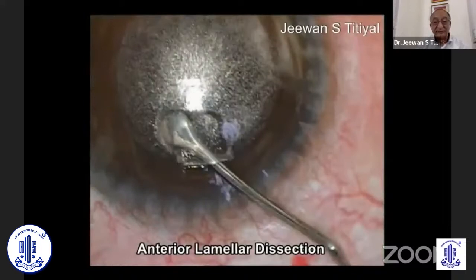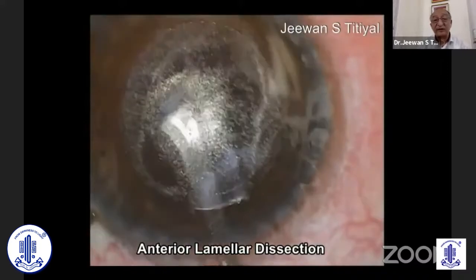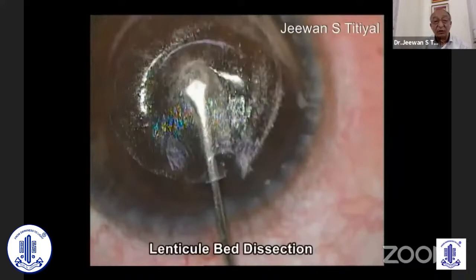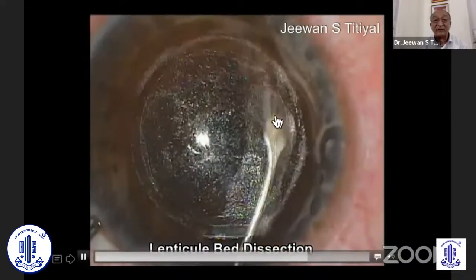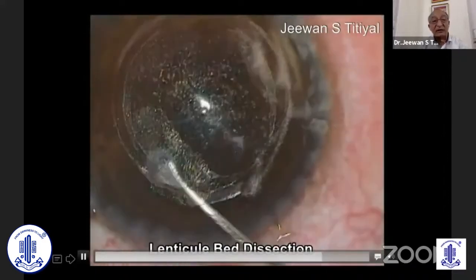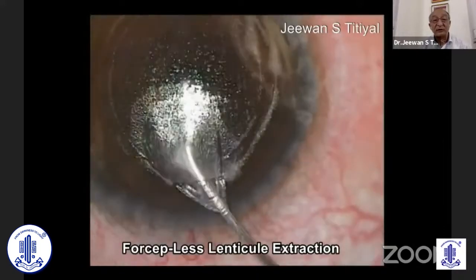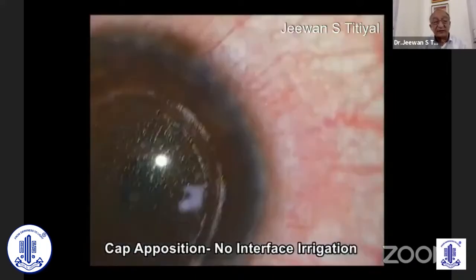Go anteriorly towards the left hand side, avoiding the edge you have created towards the right hand side. Make sure you have a smoother dissection into the pupillary area — this is very important. You can see how, in this left eye, many people do have a little different approach for the left eye. Now I go posteriorly, delineating the edge. I release here, leaving a little attachment to the side so that you have a fulcrum to dissect completely. If you dissect out one side completely, the entire flap of lenticule goes to one side and becomes very difficult to dissect out. With a complete dissection now, you can just roll it in, make a little gola and take it out. You don't require forceps nowadays to remove this lenticule.